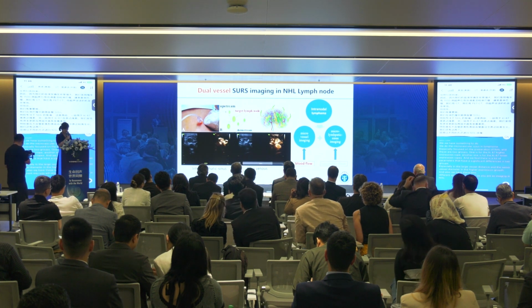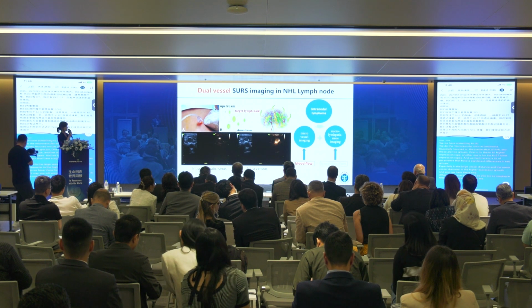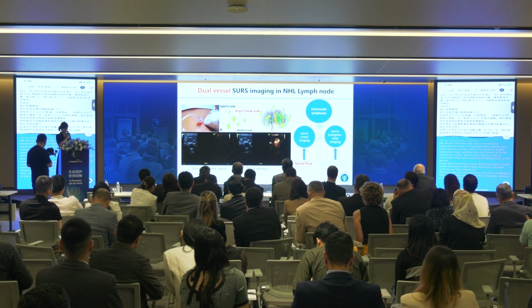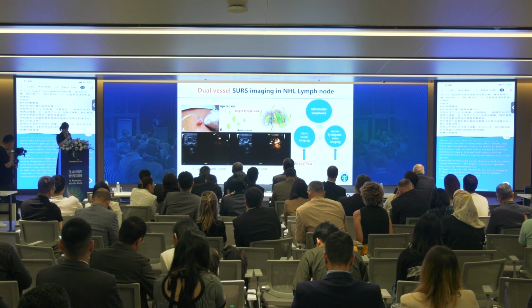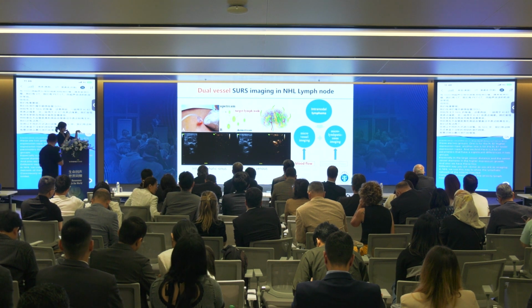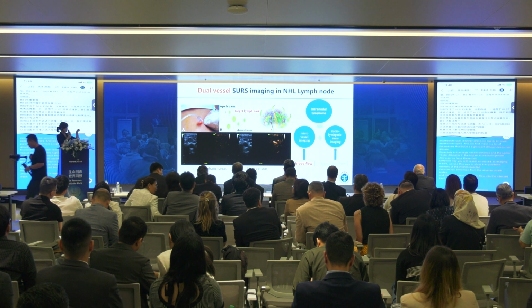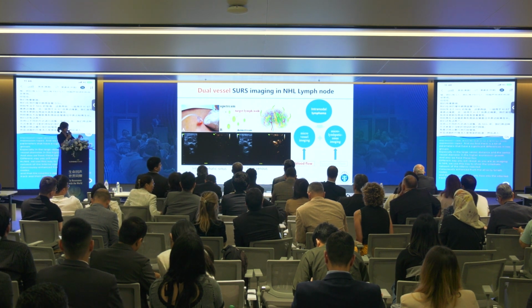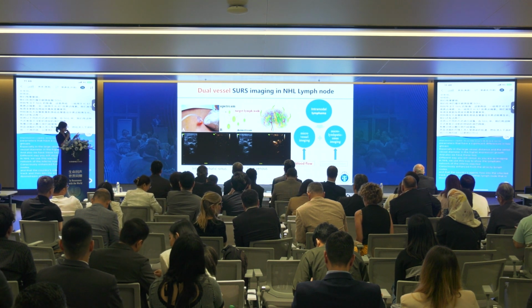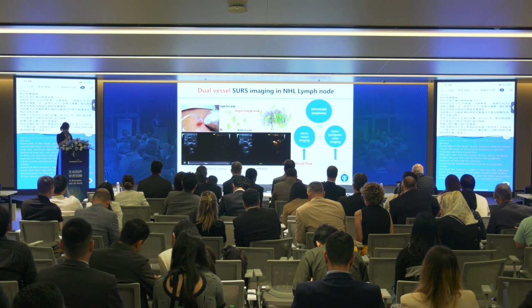We use this way to show the lymphatic network of the lymph node. We injected contrast-enhanced ultrasound agent into the upstream lymph node and let the contrast agents flow into the lymphatic tract and then into another lymph node that is downstream, so that we can see the whole procedure of contrast-enhanced ultrasound showing the lymphatic flow.